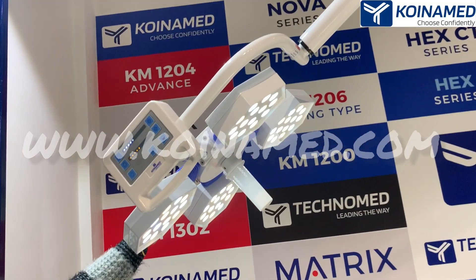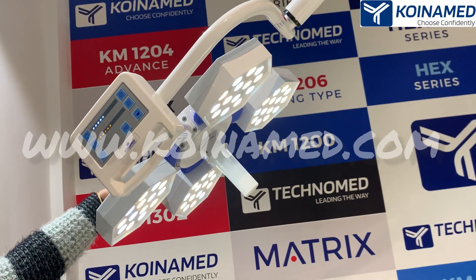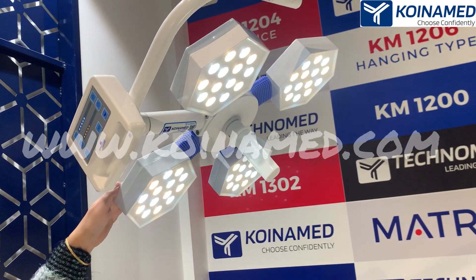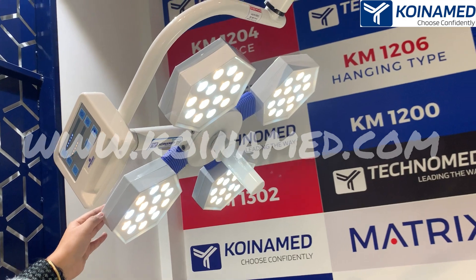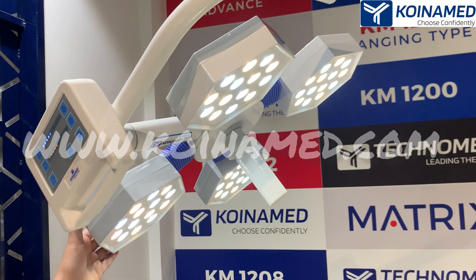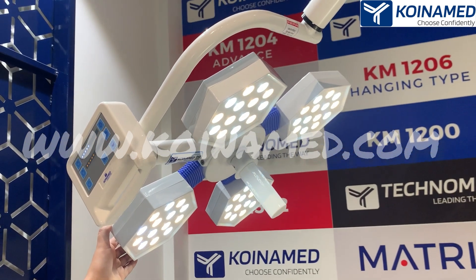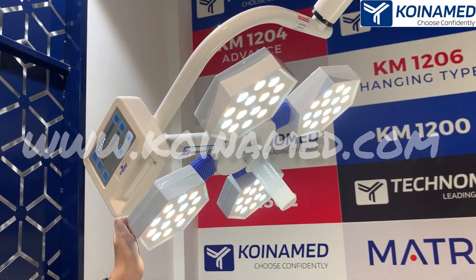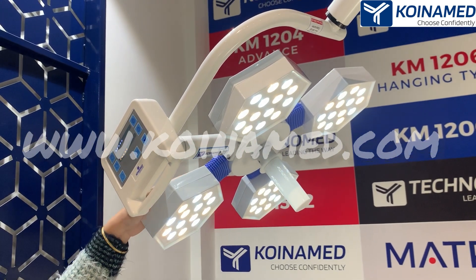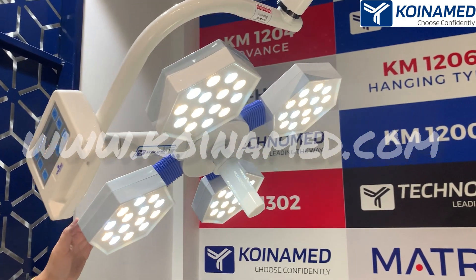Now you can have a look at this Hex CT4 14 LED series dome. The body of this dome is made up of high quality fire resistant polymer. The LEDs are from Osram made in Germany. The total number of LEDs are 56 and the total intensity of this dome is 110,000. The diameter of this dome is 500 mm.